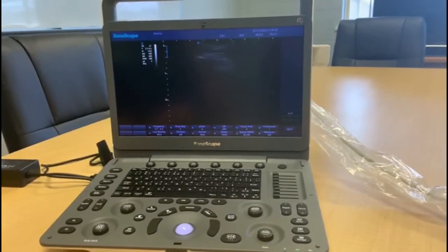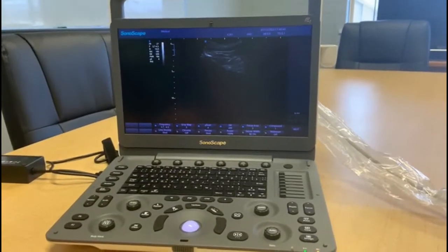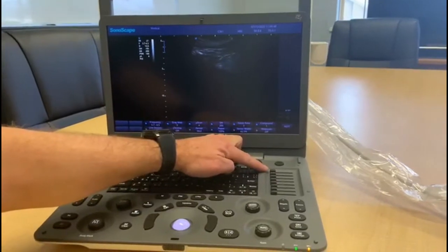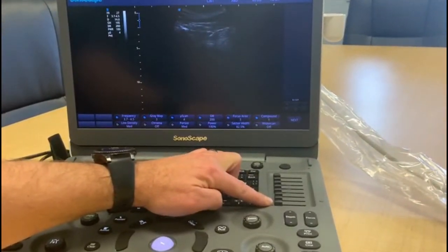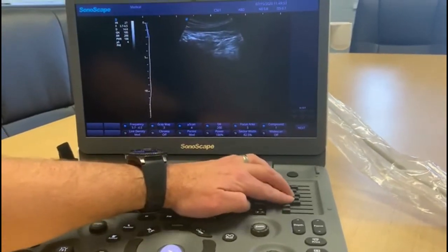We'll bring up an image here — you can see it's quite dark. The first thing you need to do is work on getting the black and white sorted to get a nice clear image. The first line of attack is using the gain buttons here, which will allow us to bring in some more whites.